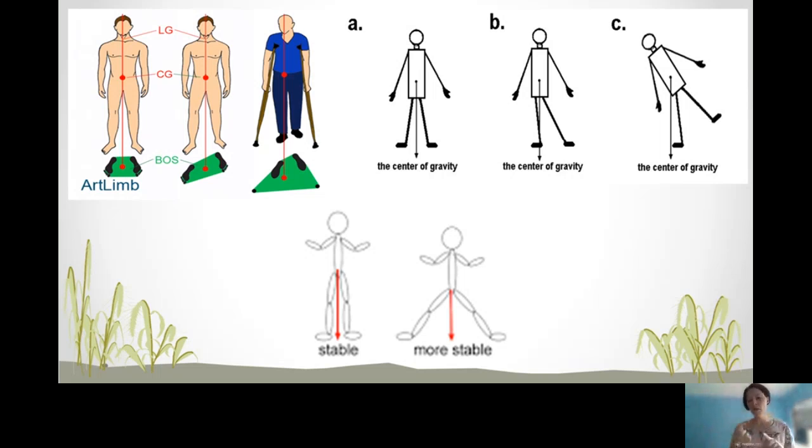Number 1, communicate to them the precautions they need to take. Make sure you have implemented the precautions of removing socks, making sure the surface is not wet or slippery. Make sure the mobility aid is good to walk with and safe to walk with.